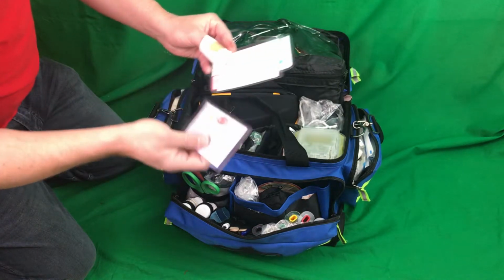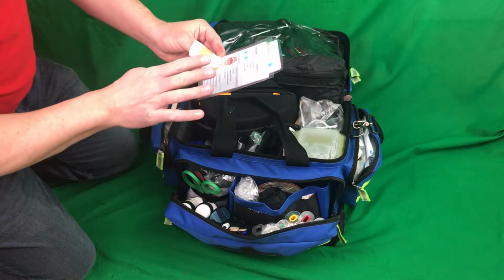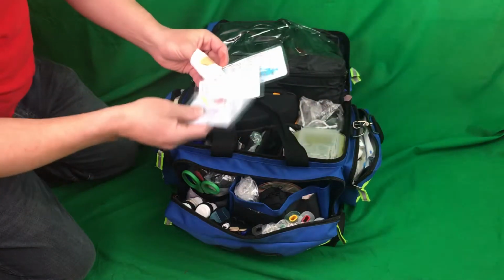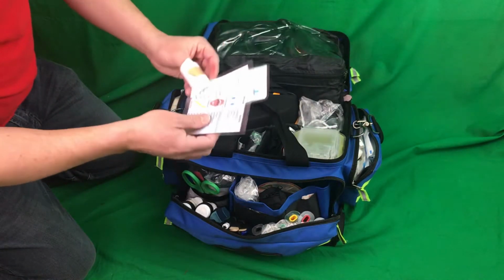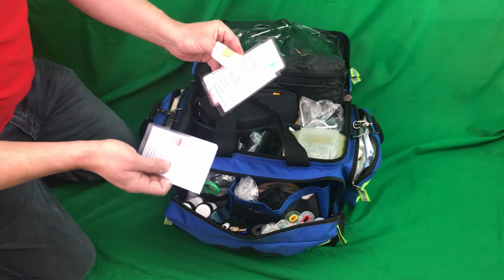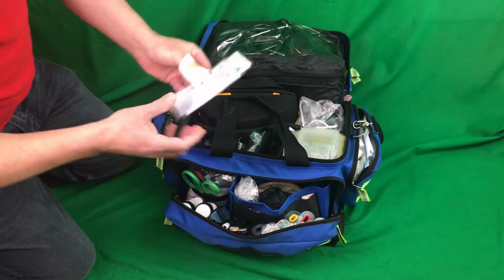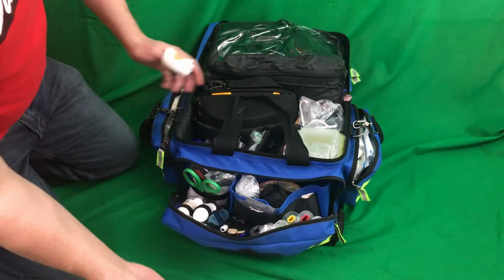I made these not primarily for me to remember, which is good for my memory too. But if you get to a scene with some firefighters, you can give the card to them and say, go check on the other guys, and they have something with them. It's pretty cool to have, and it gives you a reminder too if you're not used to using these. When I teach, I put these in the teaching bags and make sure that people have a good foundation of how they're doing their course. It gives them confidence that they have what they need in the bag. Some band-aids, and that's pretty much it.